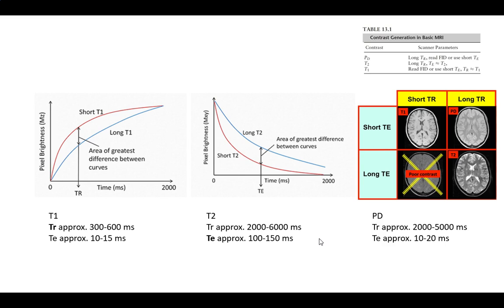So this is fast decaying materials and slow decaying materials within your body. This is the range. Between those curves, that's the contrast you can get on your image. If you're over here, you have almost no contrast. If you're up here, you have almost no contrast. So you have to find a spot in between.